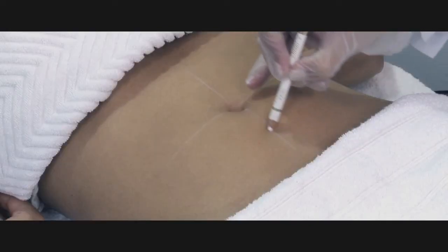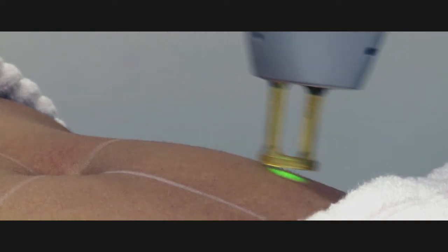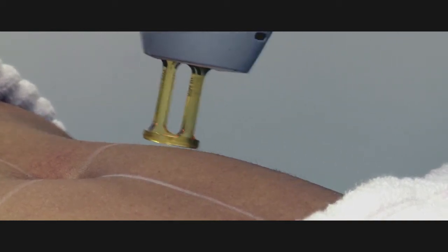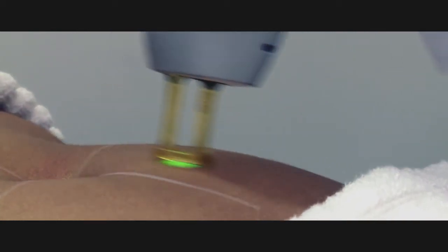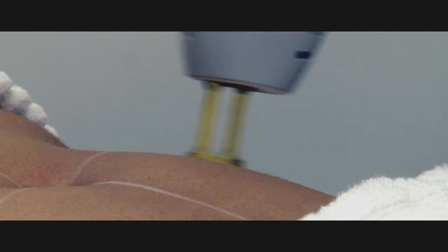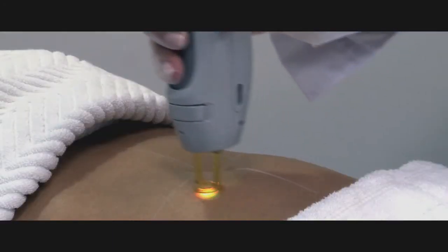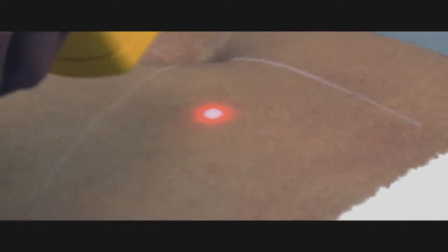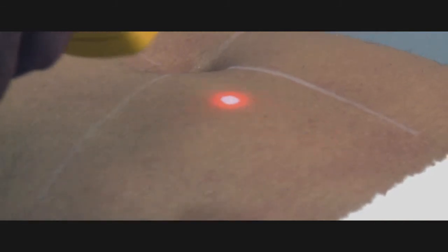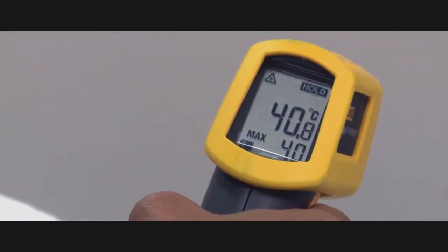The handpiece is held from one half to one centimeter above the skin and moved rapidly over a small zone that is marked with a white pencil. The zone is heated with multiple rapid passes until a temperature of 40 to 42 degrees Celsius is reached.